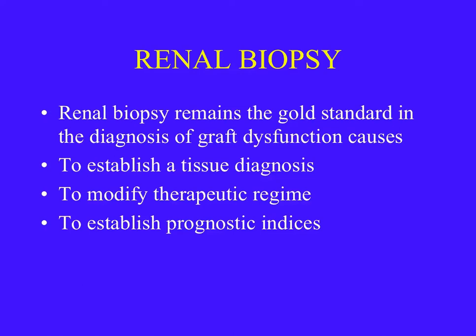Despite the recent introduction of several modern diagnostic procedures, the renal biopsy still remains the gold standard in the diagnosis of the causes of graft dysfunction. It is an essential tool to establish a tissue diagnosis, to modify the therapy, and also to establish prognostic factors that may affect long-term graft survival.